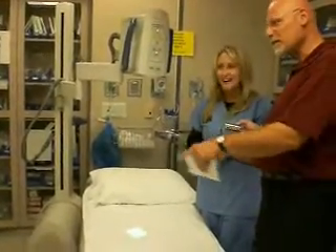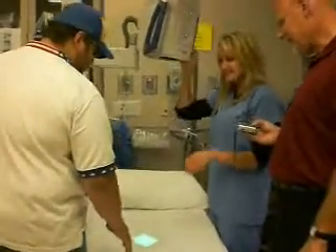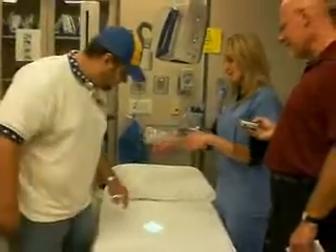We have a kid at heart here — we've got Ben here. Come here, Ben. Show us how this thing works. We'll use your left hand. Can you take this off? No. Oh, no.